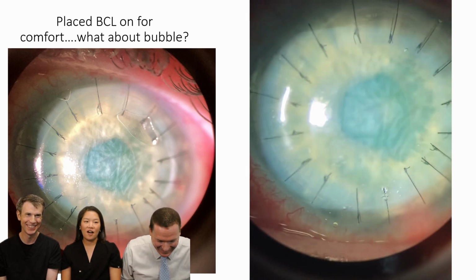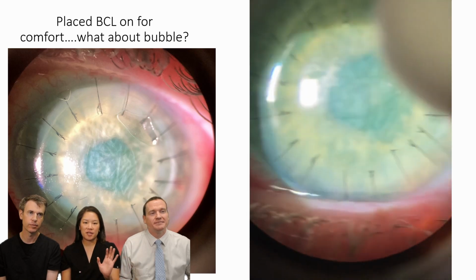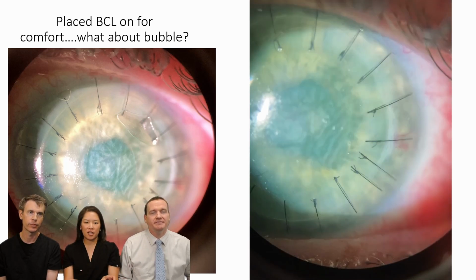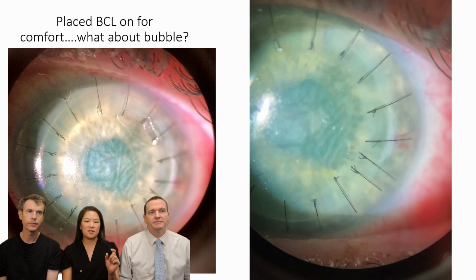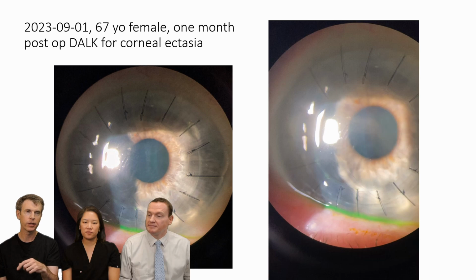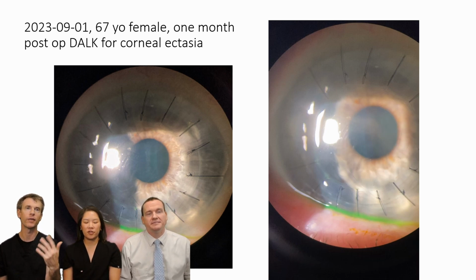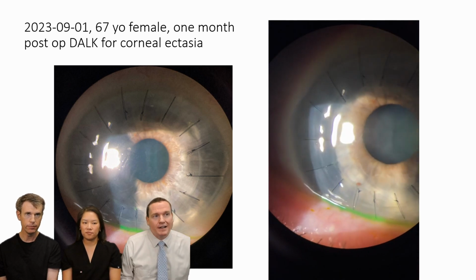And that happens with any type of irregularity in the cornea when you're placing the contact lens. So especially after a transplant, you're going to get kind of like a donut of raised tissue. That's normal. It'll eventually flatten out, but the post-op day one contact lens is very prone to bubbles just like this. So don't leave them in. And the other trick besides moving it out of the way or milking it is placing a cannula behind it and filling it up. Almost think of the scleral lens, but on the eye. By a month, these have resolved their clarity pretty nicely.